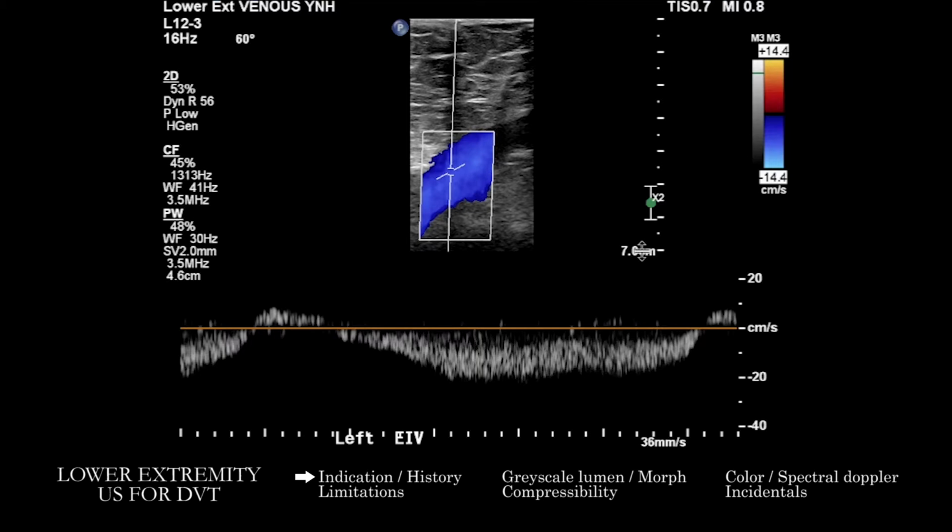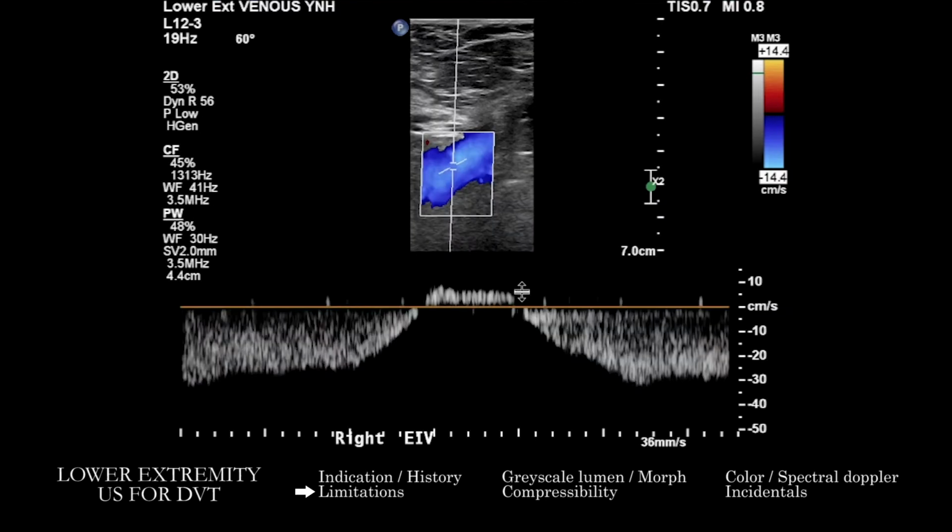One of the important things to consider, in addition to the presentation, comorbidities, things like that, is whether the patient has focal, like unilateral or bilateral symptoms, or they have central cardiac or systemic cardiovascular issues, whether they have any sort of known focal symptoms that may actually be attributable to the arterial or soft tissue areas rather than the venous anatomy, and that can clue you into things that you may see incidentally.